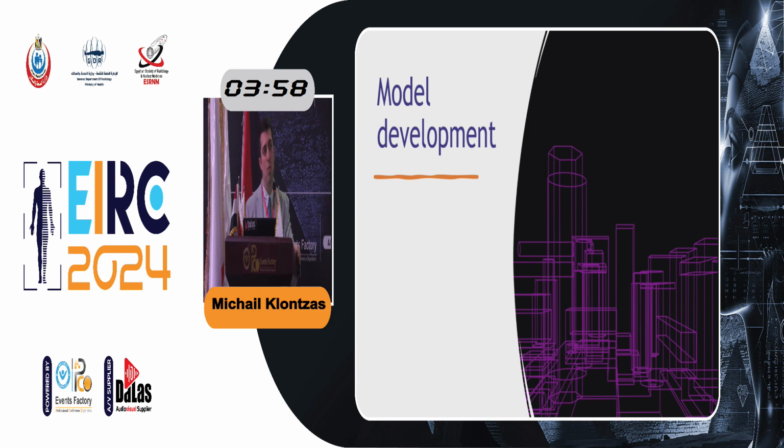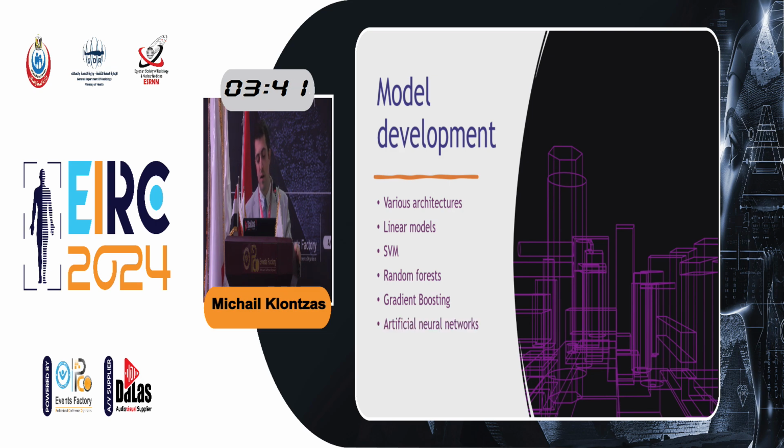And finally, what you see, the tip of the iceberg that you see in publications with radiomics, is the development of models. And of course, you have various architectures, starting from simpler models and smaller traditional architectures like SVM. And of course, you can use even neural networks and deep learning to analyze and create more complex models with radiomics. These are not very common, because complex deep learning models are, let's put it this way, an overkill to analyze radiomics data.